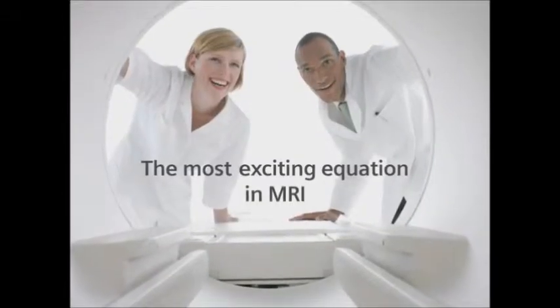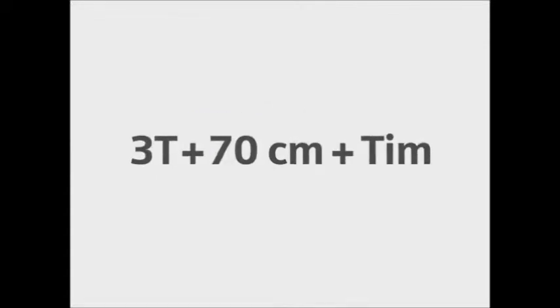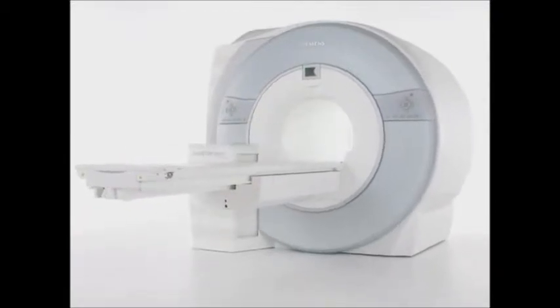Introducing the most exciting equation in MRI: 3T field strength plus 70 centimeters plus TIM. It all adds up to Magnetom Vario, the newest and most feature-rich 3T MRI system available today.